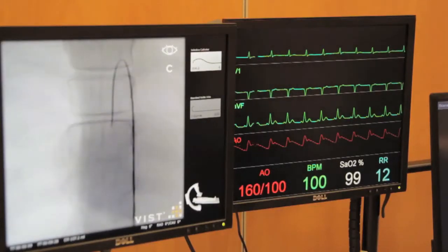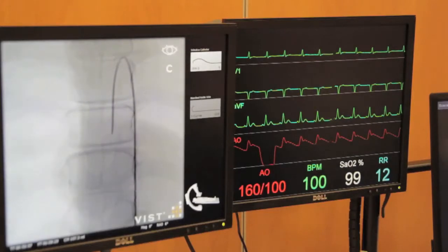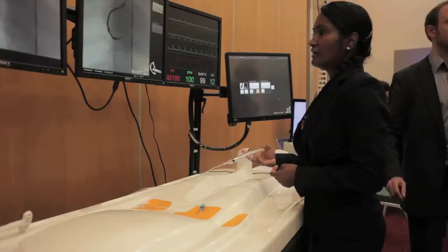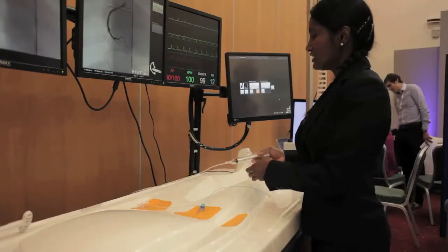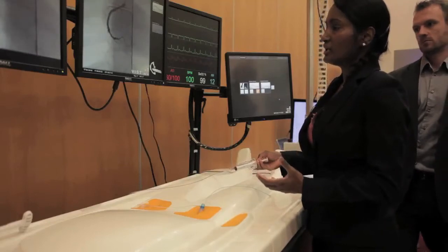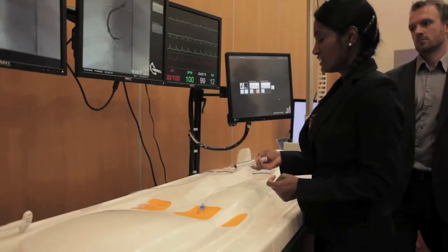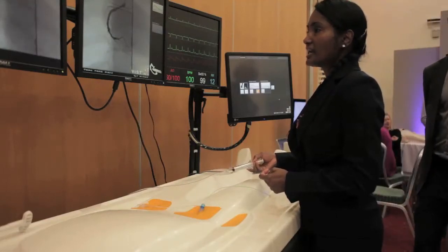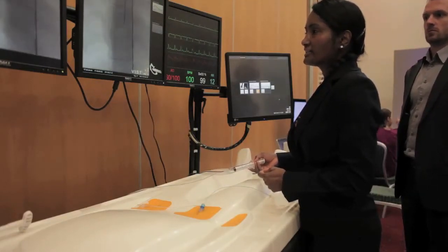You acquire an image and we will also go to a PA cranial view. It is very important to look at the coronary artery in different angulations, with the same idea of not missing any stenosis that might be eccentric.